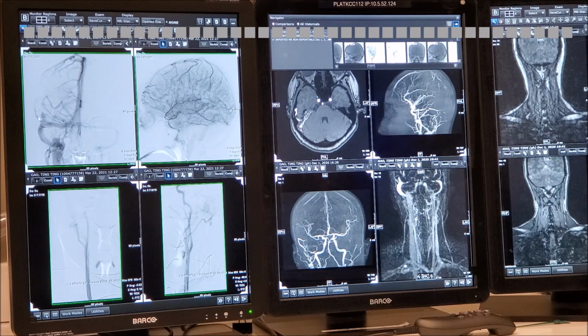There is an interesting diverticulum here. This actually could be another cause of hearing a noise. Like a dead end. Yeah, and actually it could be a very disturbing noise. A guy in France, what's his name? Udar, presented that when he started coiling these things, the noise goes away. So if after you fix the fistula the noise doesn't go away, you bring the patient back to treat this. Are we together? Yeah, absolutely. So we continue.